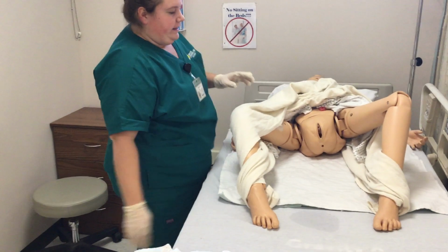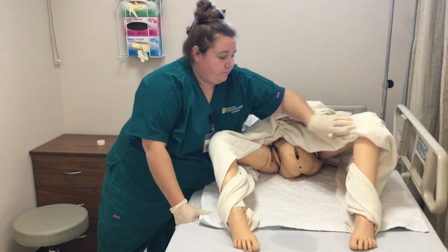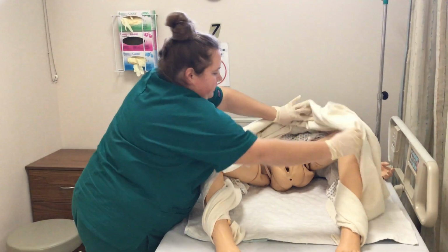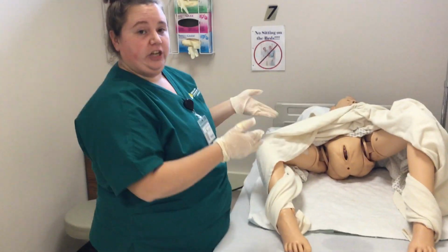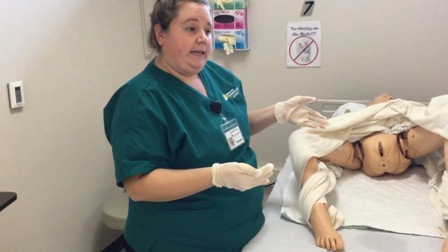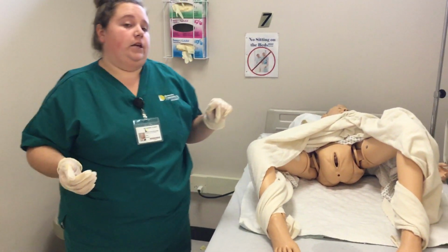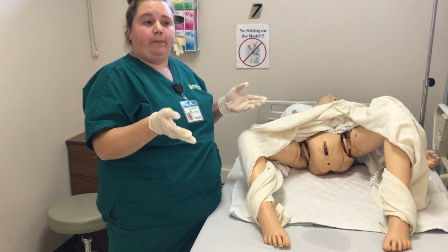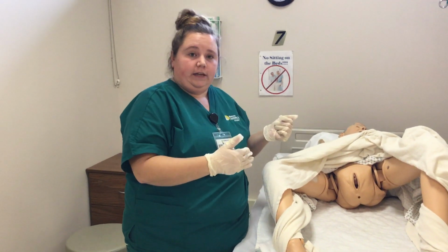So now that I've got the patient in the recumbent position and draped properly, I would illuminate a light on the genitals so I can easily identify the urinary meatus, which is right there. And if needed, I'd have my assistant help me shine or hold the light on the genitalia.